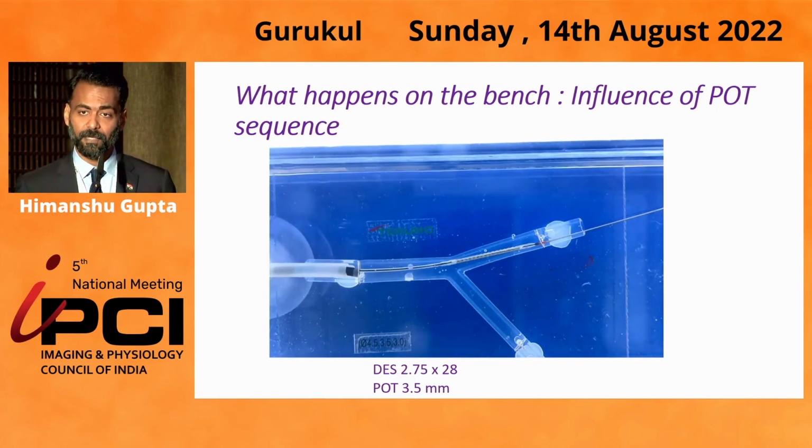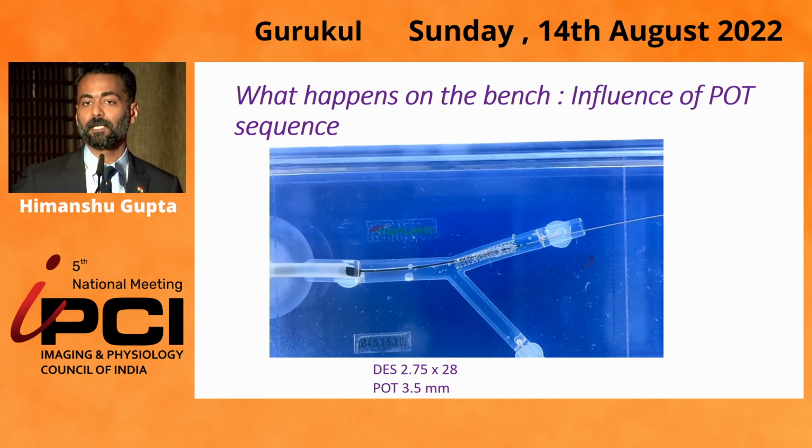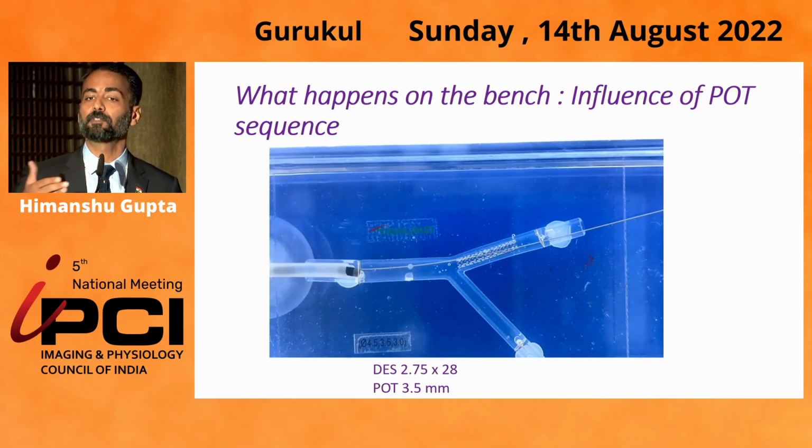This happens in the left main, this happens in the LAD, this happens whenever you start the POT distally. So the proximal part of the stent has no axial support. So you start dilating from distally to proximally, and the stent keeps on elongating. So if you had started at the ostium of the LAD, it comes into the POC or in front of the circumflex. This happens in the left main as well. If you do a crossover with the 3.5 and you start the POT balloon from distally, by the time you finish the POT, the stent is hanging in the aorta, it comes to the guiding.